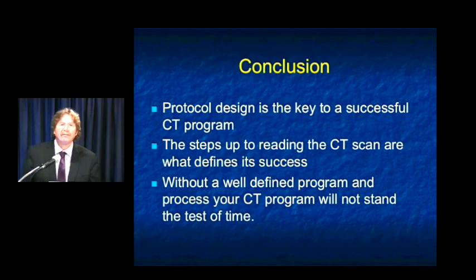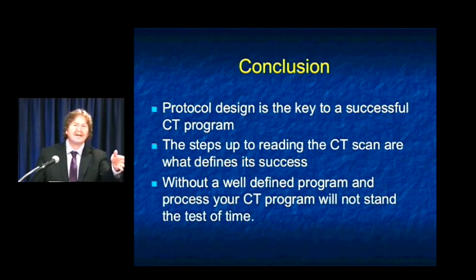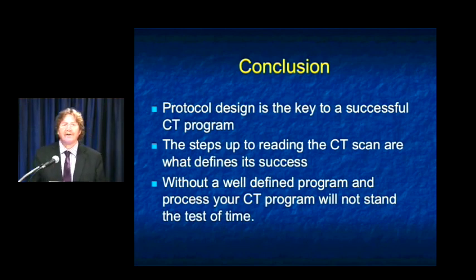So concluding then, protocol design is the key to a successful CT program. The steps up to reading the CT scan are what defines a success. You notice in this talk, I did not speak about how we read the studies. I spoke about everything up to the point of reading the studies. Without a well-defined program and process, your CT program will not stand the test of time. So if you're not doing what I suggested, there's never been a better time to start.